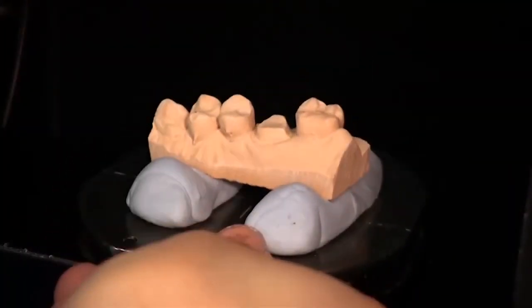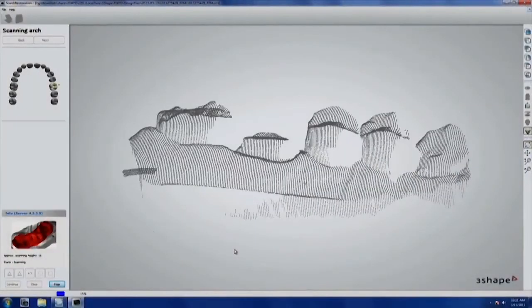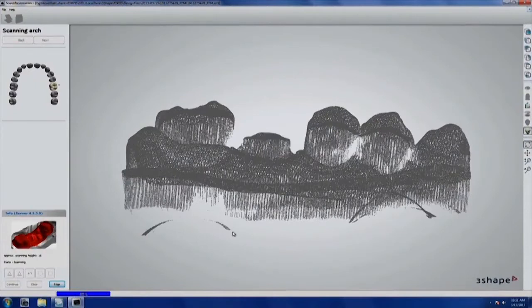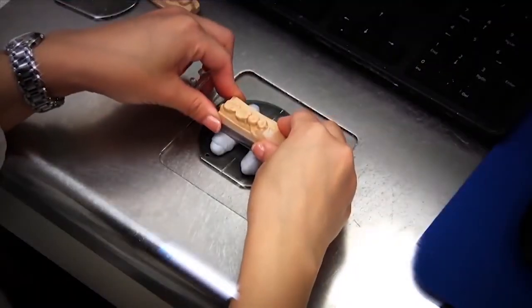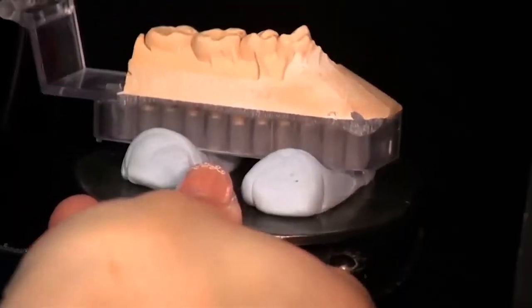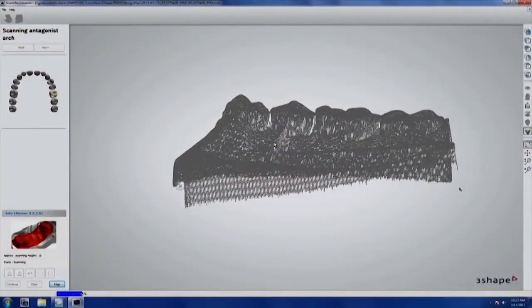a 3Shape scanner. We want to get this into the digital environment as quickly as possible because everything works better for us in the digital environment. It's so much more consistent. If the dentist had sent a digital impression, then we would start right from that, but we had a conventional impression, so there's no really good impression scanners out there on the market, so we still have to pour the model in stone, and now we're going to scan it and bring it into the digital environment.